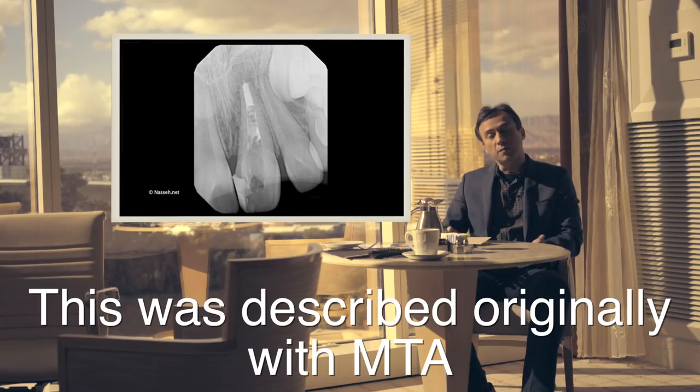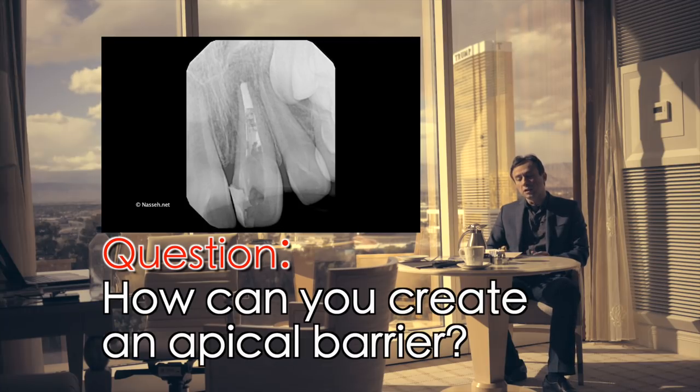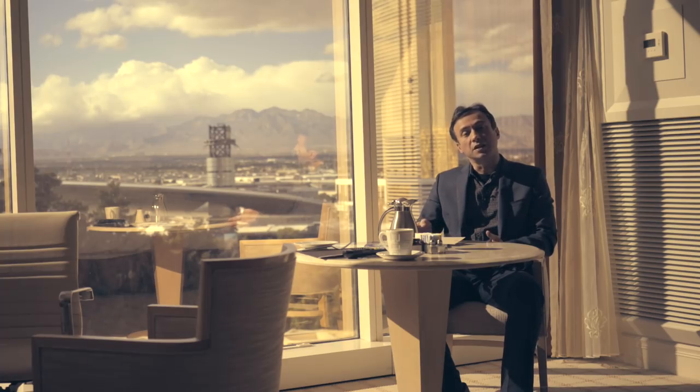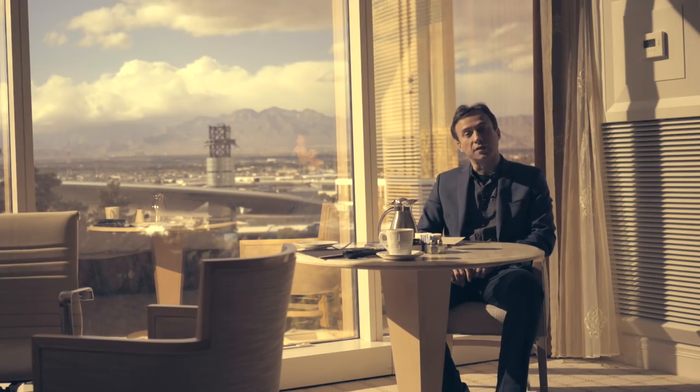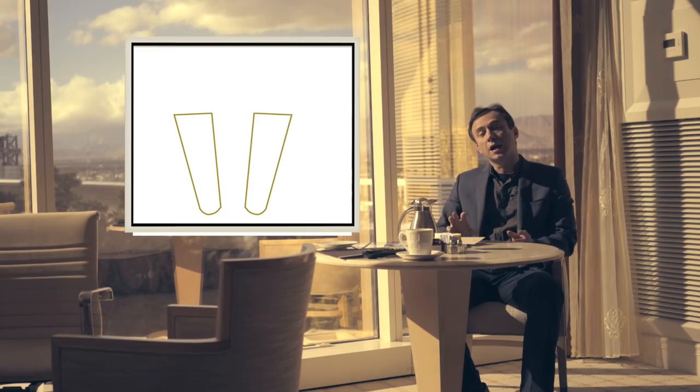In those cases, the use of an apical barrier has been advocated by many people as a better way of creating an apical seal. From that point on, you can fill the rest of the tooth back up. The question was how can we create an apical barrier. Originally we used MTA for this — you basically place a collar coat at the apical area and place small incremental layers of MTA to create that barrier, then filled the rest of the tooth up.